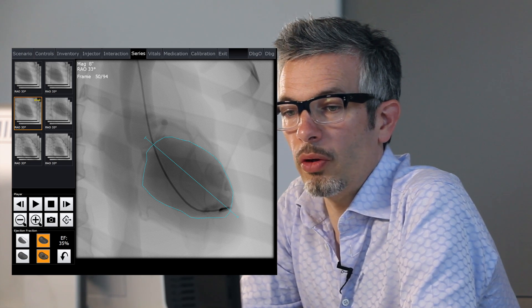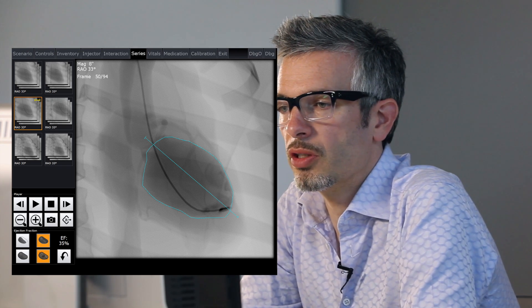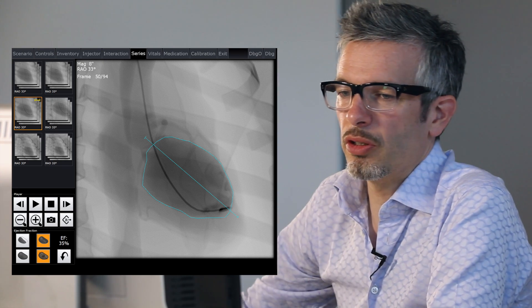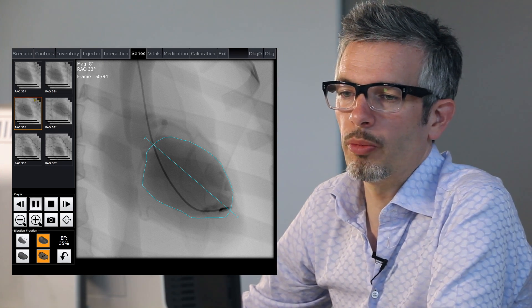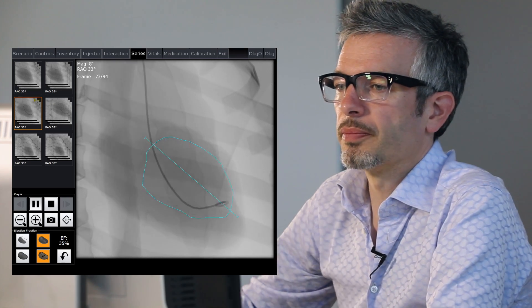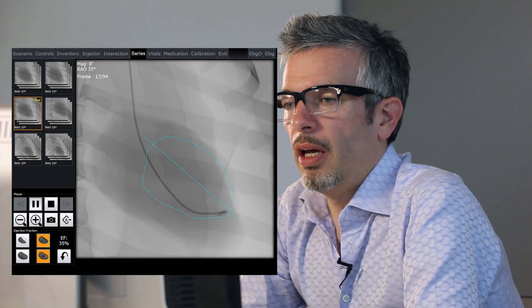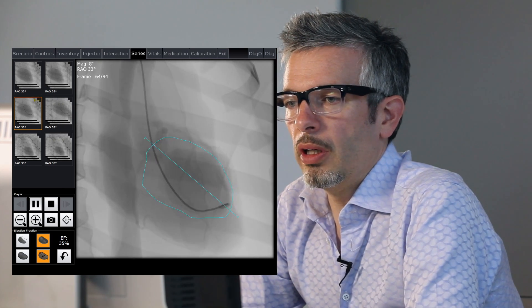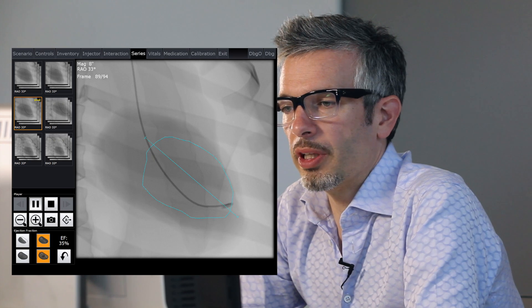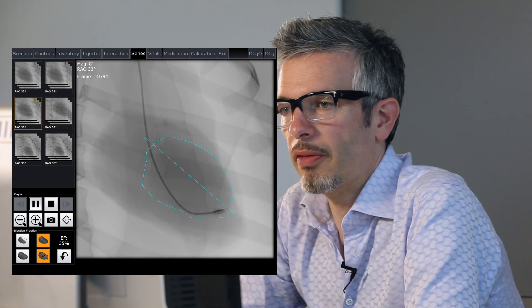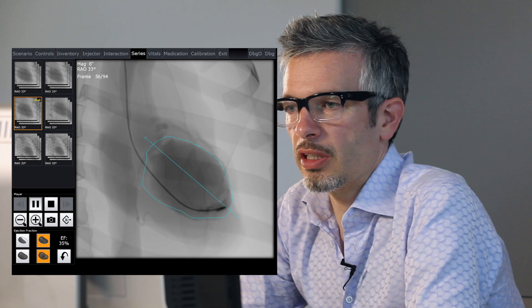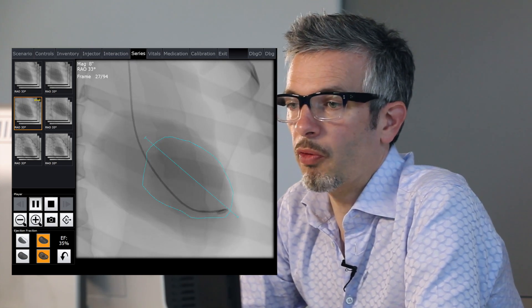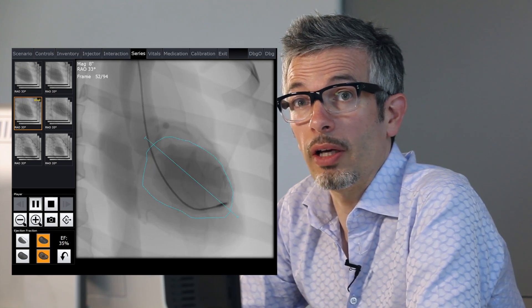As you can see, our ejection fraction is really quite low here — 35% — just into the realms of severe left ventricular dysfunction. And that's really the impression that we got visually from this LV gram, where we could see that the degree of contraction was pretty small. There were a number of beats before the contrast was completely cleared from the left ventricle, and we could see this dyskinetic segment of the anterior wall. And that's how to perform left ventricular angiography.